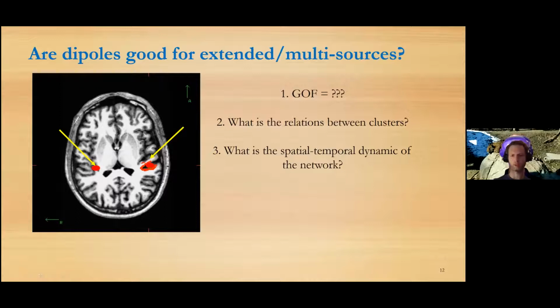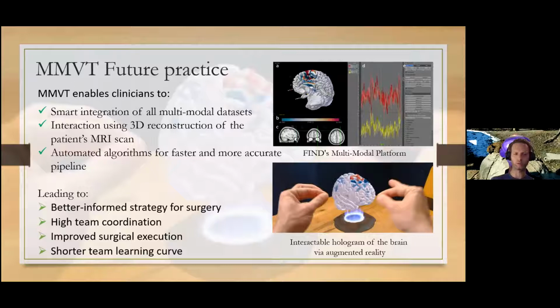Thank you, Vanya. Okay, because everything is about surgery and surgical decisions, we also included automated algorithms, which I'm going to talk a little bit about, that help clinicians, for example, localize the invasive electrodes and also find epileptic seizures. This is how the tool looks. I'll give a short live demo. It has two parts: the user interface and the pre-processing steps, currently command line modules, that can help clinicians analyze the data from raw until statistics, and then import the data into the tool.